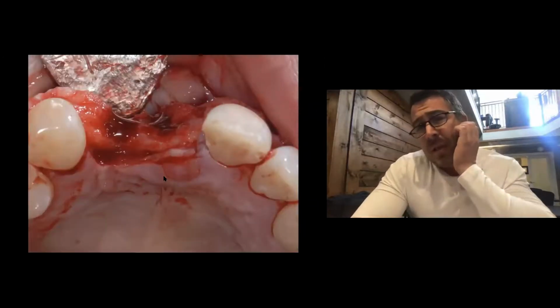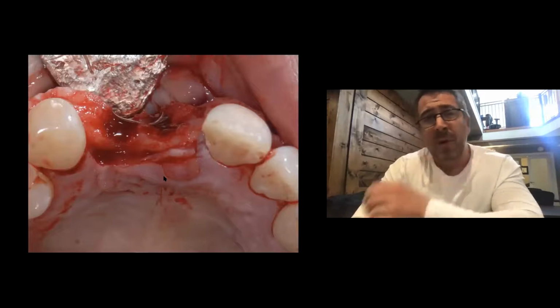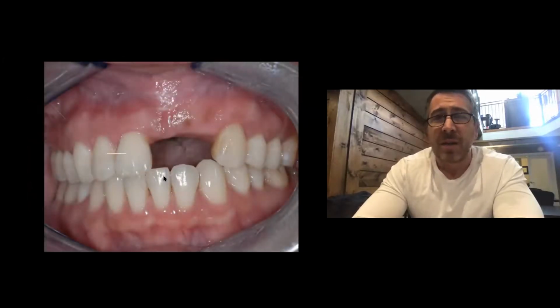So this is what a defect looks like. We've got a buccal lingual defect. And we also have a vertical defect. So we start to reconstruct it. So this is how she presented. And after our first round of reconstruction, this is how we ended up. And then I did a second round of reconstruction.